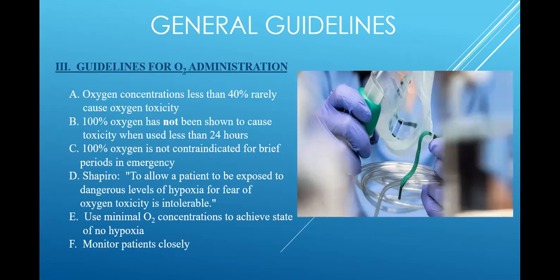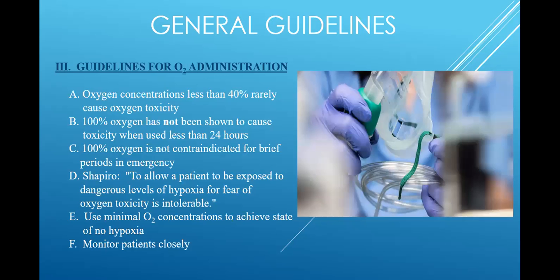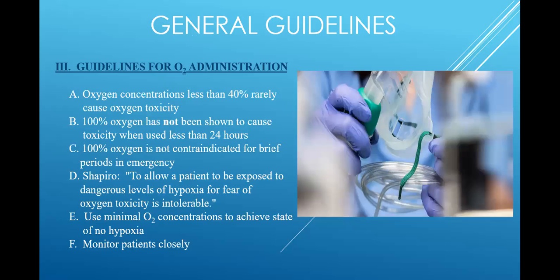10:35, we're going to do the general guidelines of O2 therapy. In fact, don't take a break here. I'm going to do the general guidelines of oxygen therapy, and then we're going to stop because I don't want to go into low flow systems and then stop you. I need to give you low flow and high flow on the same day. So we'll be doing low flow systems and high flow systems starting in the morning. This is when we're getting ready to talk about who qualifies for low flow, who qualifies for high flow, and how do I know that? How do I make that distinction?